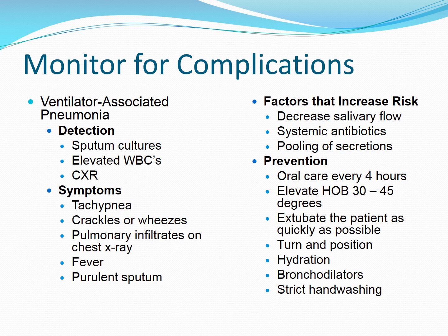And one of the main complications that we see is ventilator-associated pneumonia. And this is very high in patients requiring mechanical ventilation because the endotracheal tube or the tracheostomy tube bypasses the normal upper airway defenses. The other thing is that this patient is immobile.